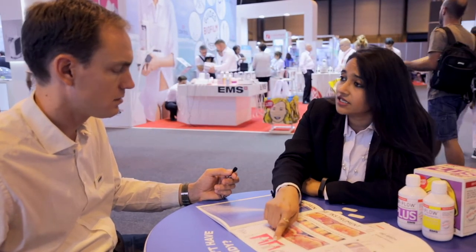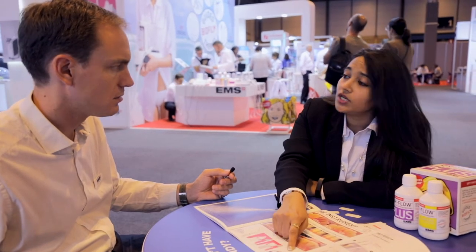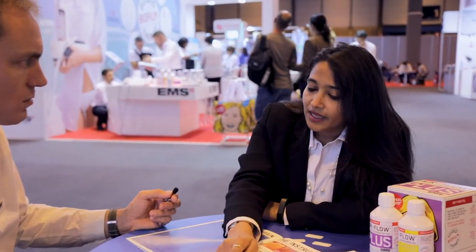When we encounter aesthetic restorations, veneers, laminates, or implant surfaces, we only use the PEEK instrument. This instrument, because of its plastic, does not scratch the polished titanium, as a result of which we are minimally invasive and very conservative with respect to implant maintenance.